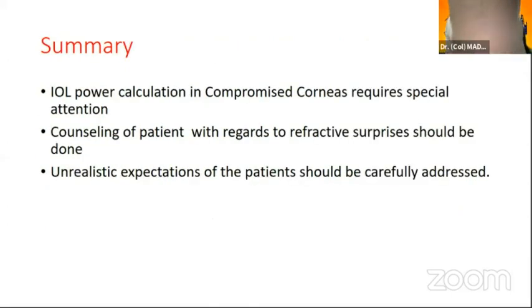So in summary, you do require a topography. If access to an optical biometer is available, that would be ideal. And most important is counseling your patient to not have unrealistic expectations, so that you are saved the trouble at the end of the surgery.